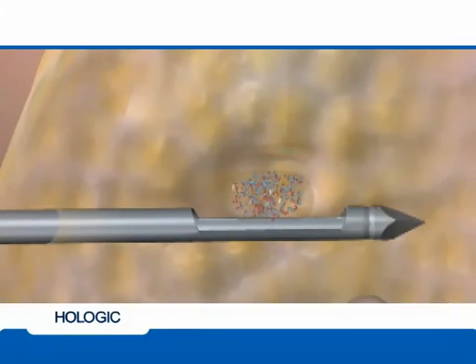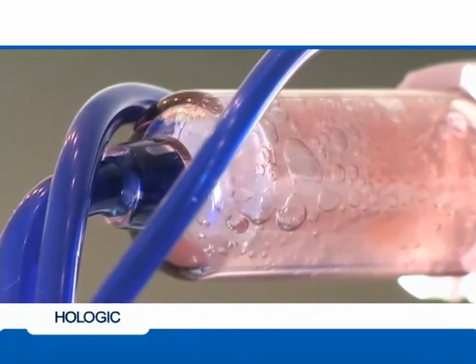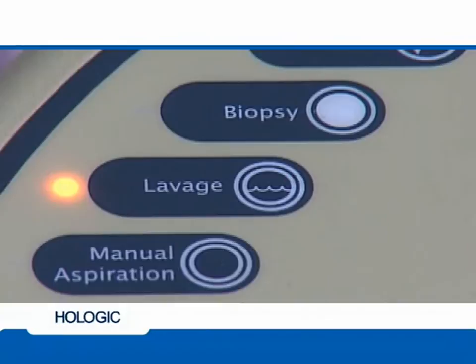Lavage mode delivers saline and aspirates the biopsy cavity, allowing loose tissue and other fluids to be cleansed from the site. Lavage the cavity 360 degrees until the fluid in the collection chamber indicates the cavity is clear. End the lavage rotation with the aperture in the 6 o'clock position.